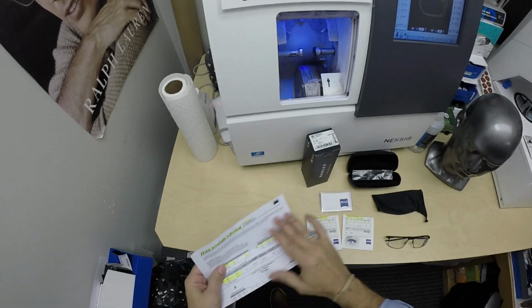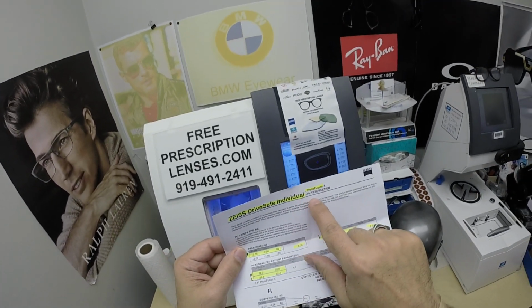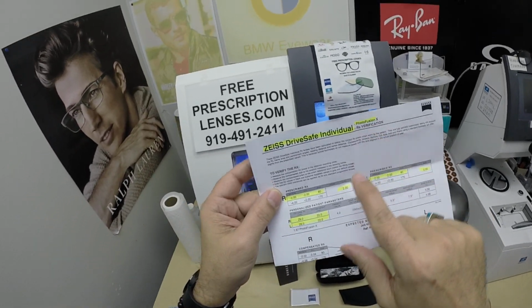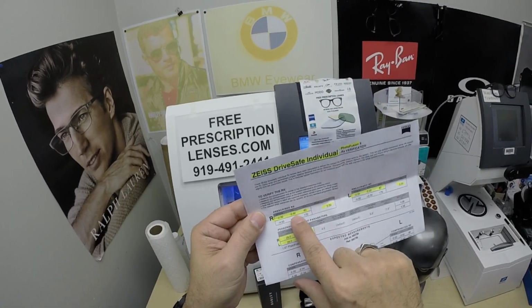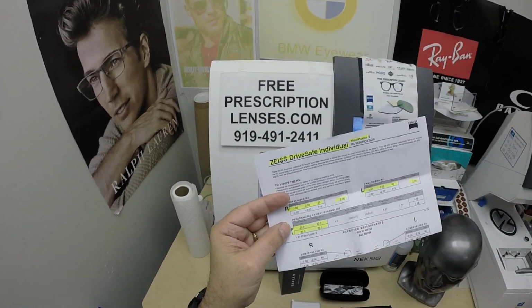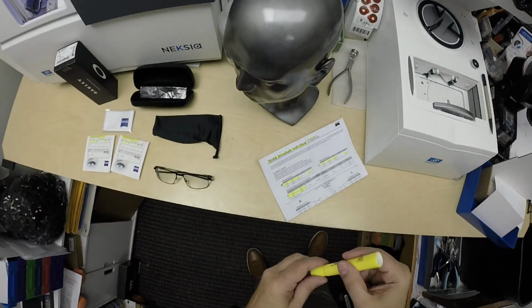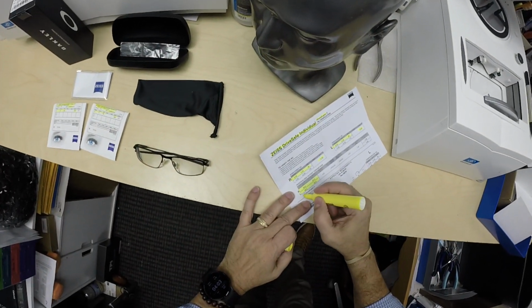And he got the really cool high-end lenses. He got the Zeiss DriveSafe Individual lenses, the PhotoFusion Extra Gray. I've highlighted the prescription in the right eye, same for the left. Pupillary distance, optical center height. This is the 1.67 PhotoFusion X Extra Gray. I forgot to highlight, let me do that.